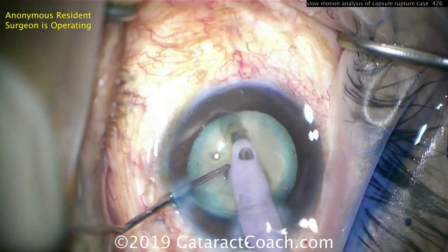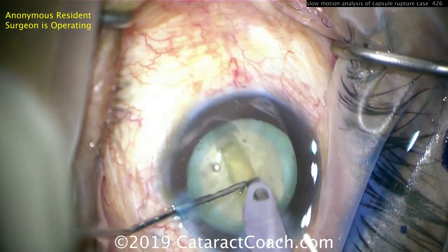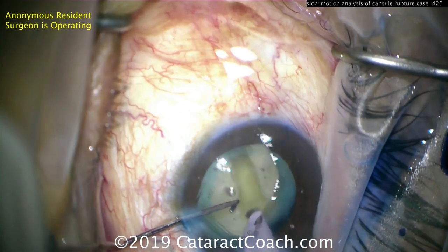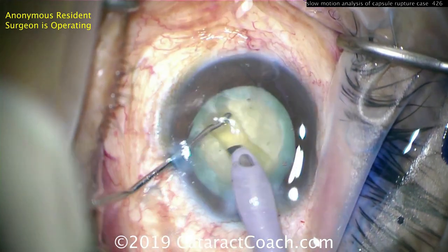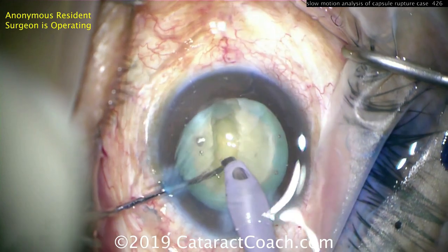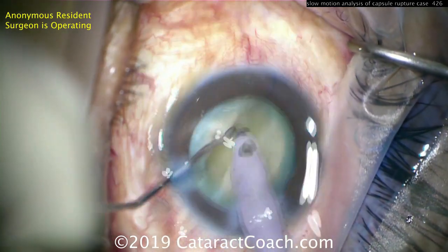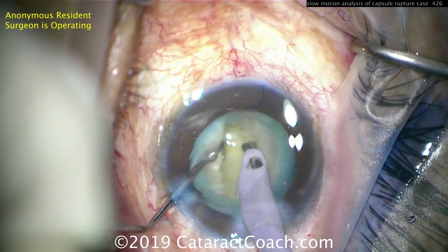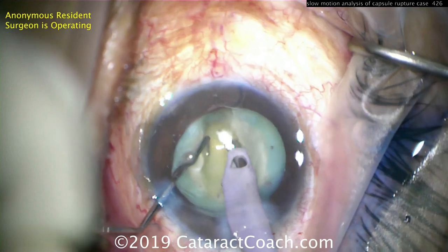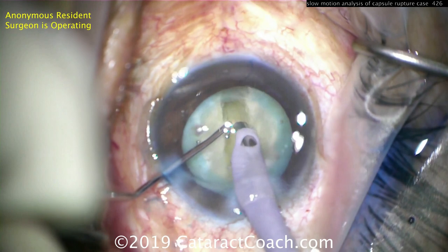Here's the groove, and right there it goes right through the nucleus and hits the posterior capsule. You can see that dark spot — that dark crescent. The resident surgeon is still unaware at this point. The dark spot in the bottom distal portion of the groove is a complete puncture through the nucleus and into the capsule.